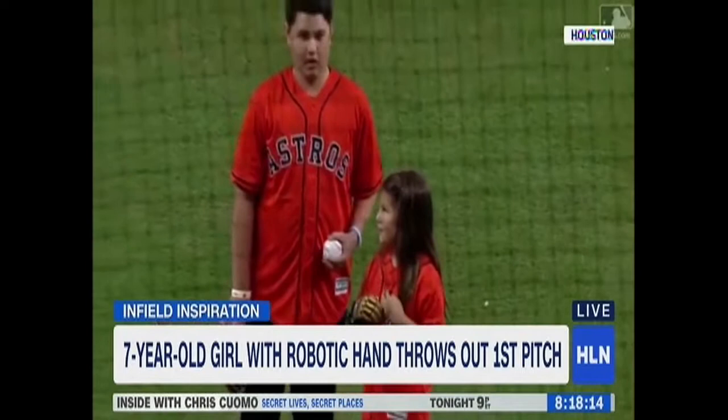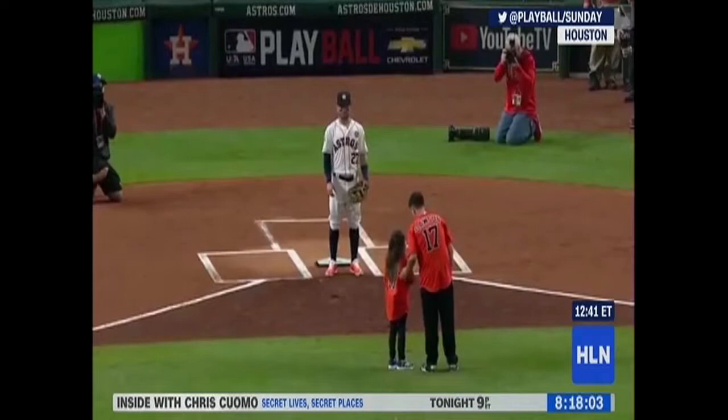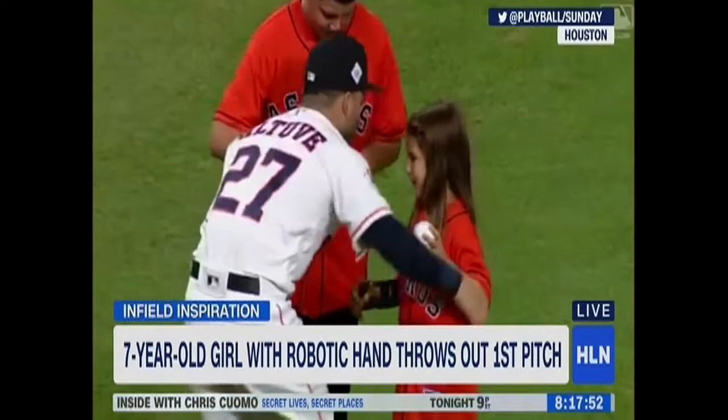The event was kicked off by a really cool kid — seven-year-old Haley Dawson. She threw out the first pitch using her 3D printed bionic hand. It was her third time throwing the ceremonial first pitch at an MLB game. Haley's goal is to throw at all 30 major league parks. She was born without three fingers on her throwing hand, but it hasn't slowed her down a bit.